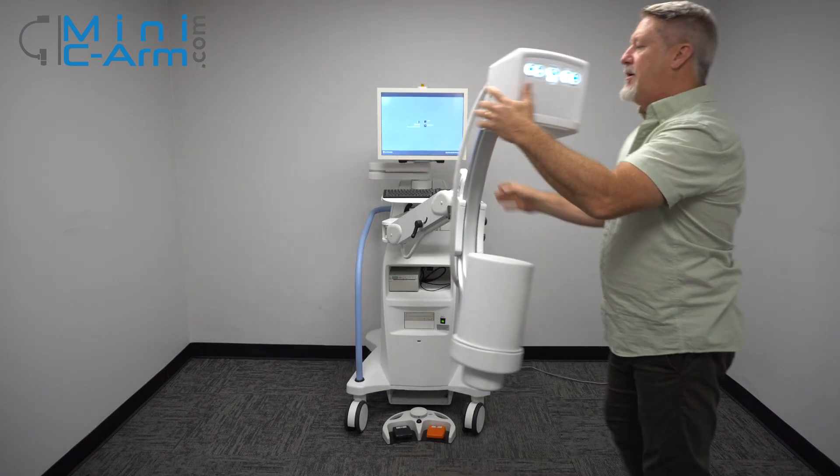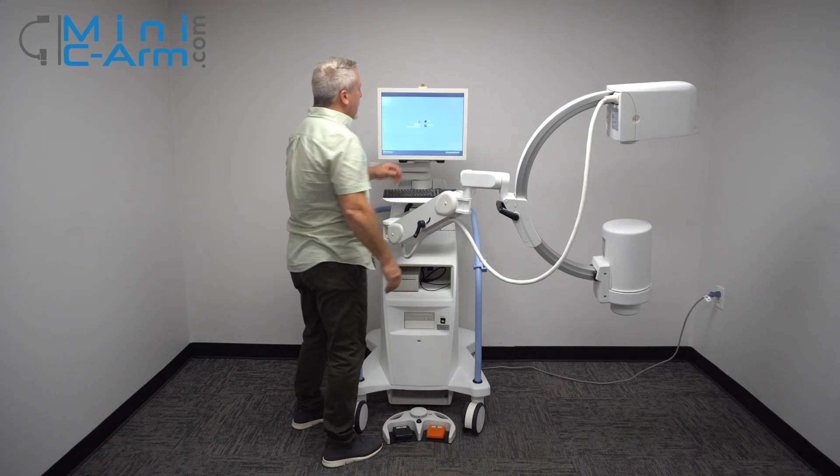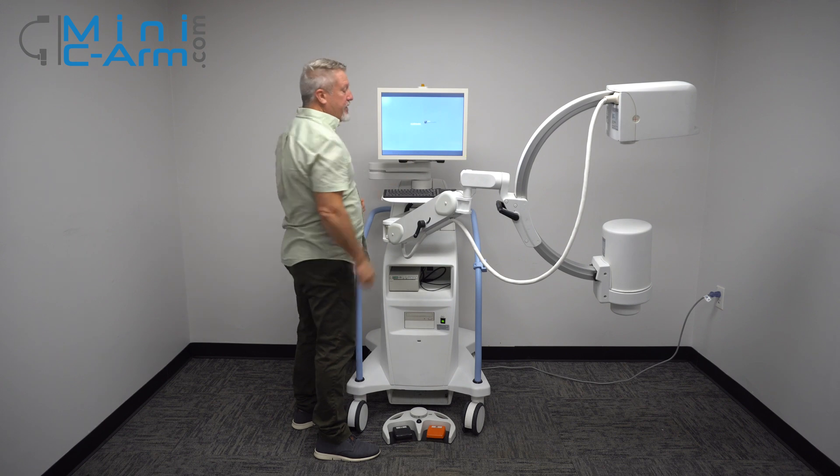Our machine has booted up here. To begin, just tap it — admin, always.